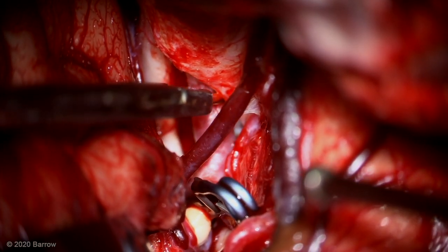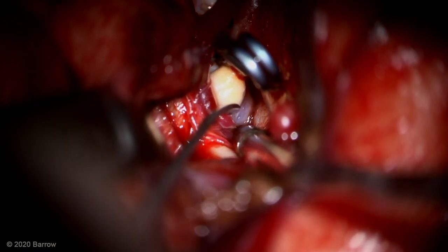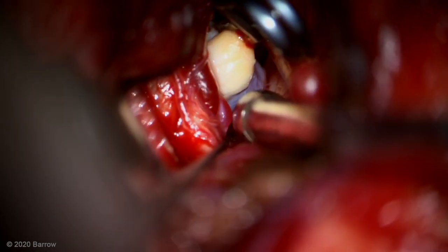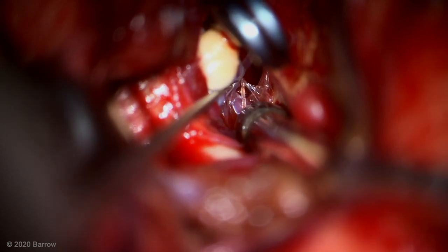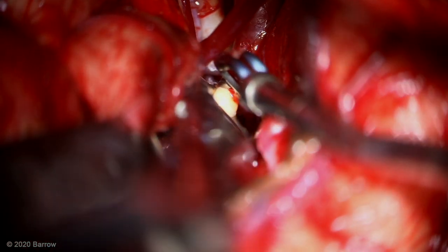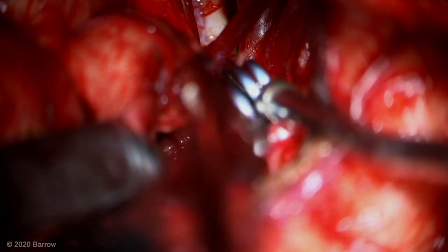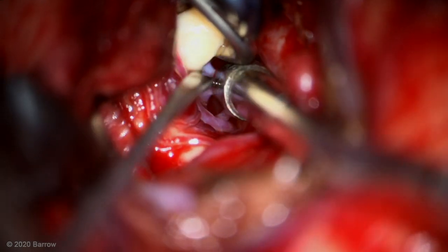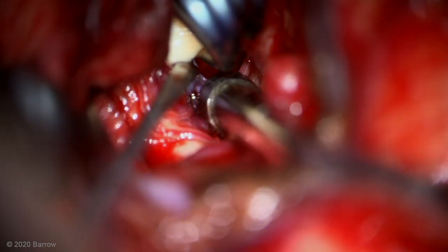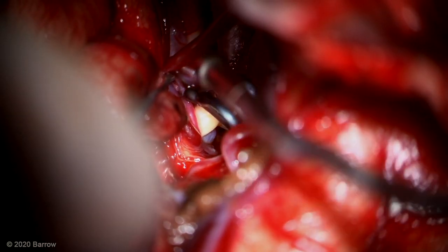The temporary clip can come off. Now I'm inspecting further. You can see these perforators on the lateral side nicely cleared away. But as I palpate the aneurysm dome, I actually feel some pulsation, which tells me that the tips of that first clip aren't closing completely. The atheroma within the jaws of the blade are keeping the tips from meeting. So this fenestrated clip goes around the atheroma and applies additional closing force at the distal neck.